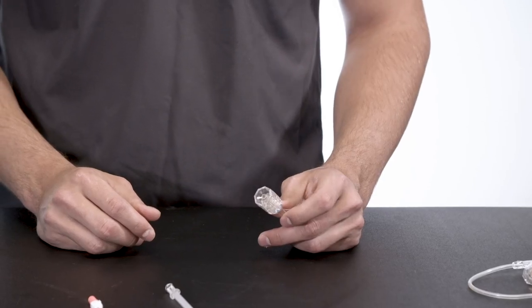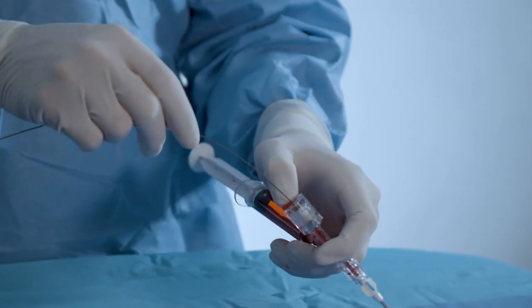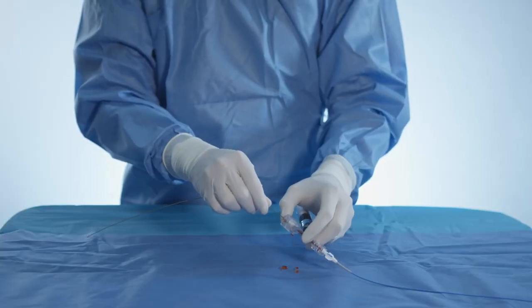The standard compression seal can be opened and closed by rotating the top of the device. When using this valve, insert interventional equipment into the top of the device and close the valve gently around it.